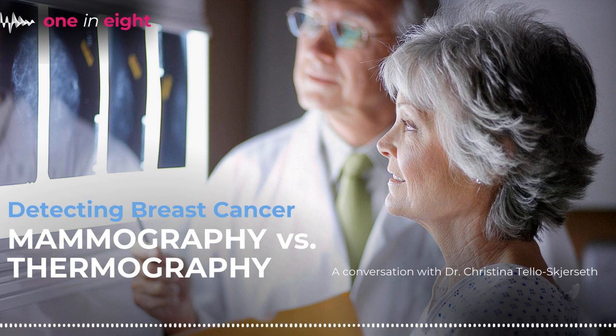The biopsy rate is quite small. The actual rate of cancer is quite small. It's about 5 to 8 people per 1,000 mammograms who will actually get diagnosed with cancer. So it does cause a lot of anxiety. Thermography really doesn't have any of that related to it, so to speak.